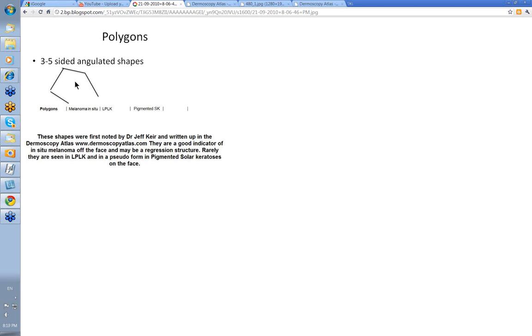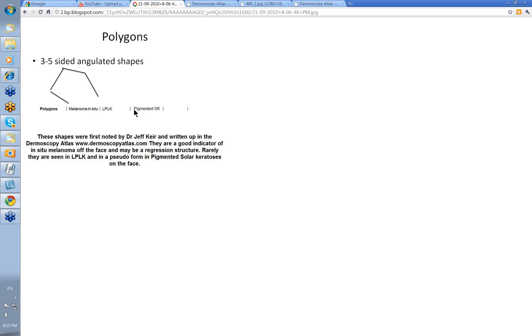Jeff's been talking about them for quite some time. They're three to five-sided angulated shapes and they're seen in melanoma in situ, sometimes in lichen planus-like keratosis, sometimes in pigmented solar keratosis, but they're almost pseudo-polygons in these and we'll show you what we mean in a second.